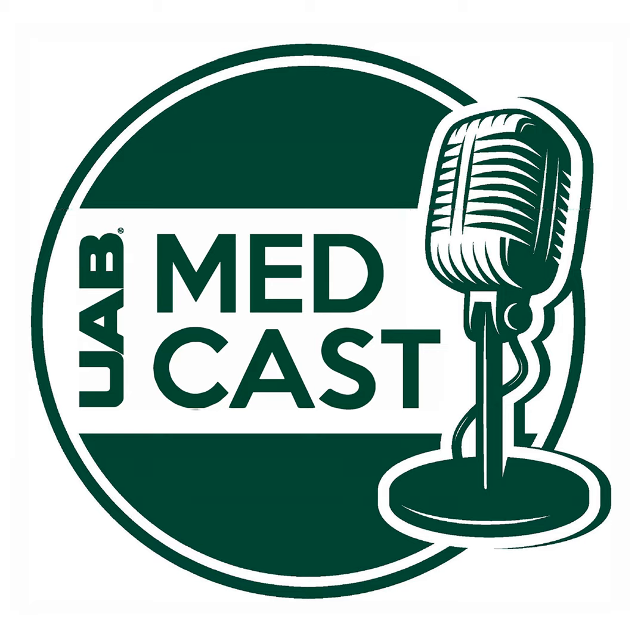Sure. Well, thanks for having us again. I always enjoy coming on this program with you. But a subperiosteal implant is a different type of implant than what people normally think of when we're talking about dental implants. The normal standard endosseous implant gets screwed essentially into the bone, whereas the subperiosteal implant sits on top of the bone, and it has a bunch of tiny little screws that fixate it to the bone.